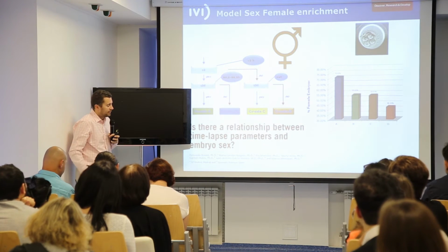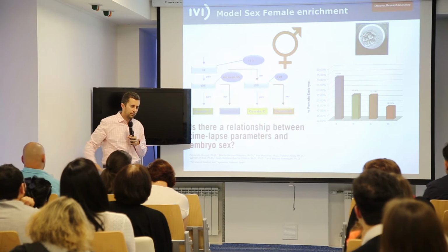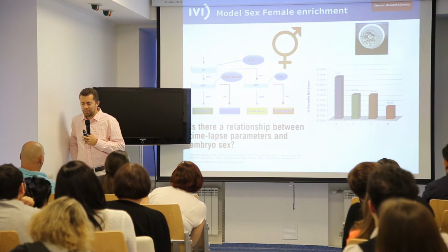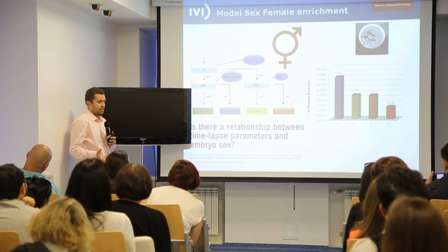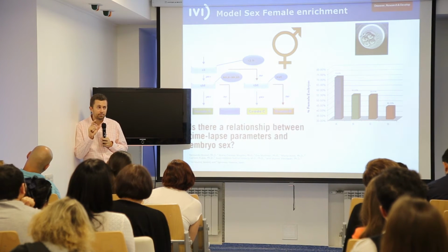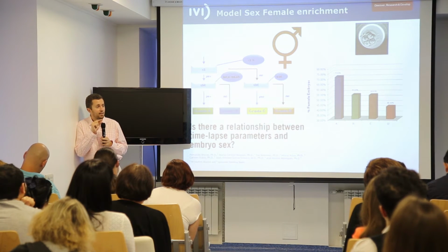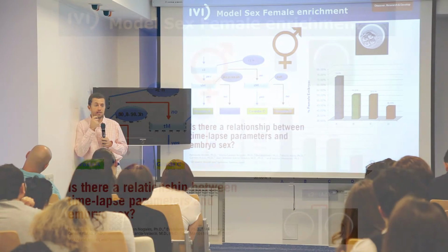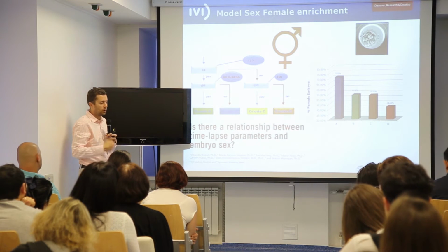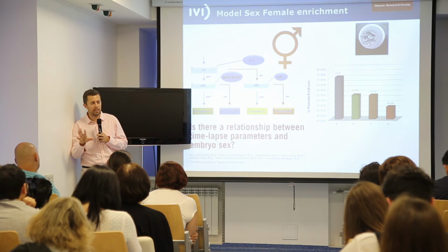Another thing, because my intention was to cover other topics: can we use morphokinetics, if we're coming from a way of analyzing the embryos that is more objective, to select better or even to do a sex selection? Well, sex selection is not allowed in Spain. It's not allowed by any basic technology, but I have no idea if we can do it by that because there's no regulation about that. So we did a publication where we tried to see if the behavior of the embryos was different between males and females.